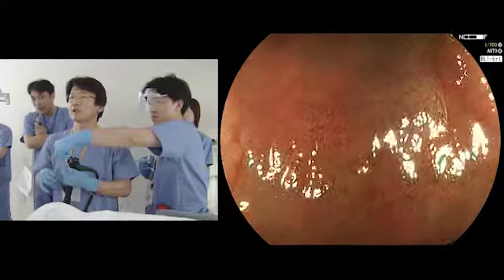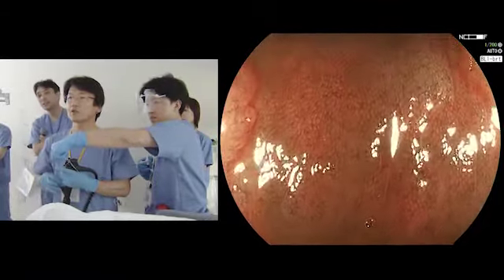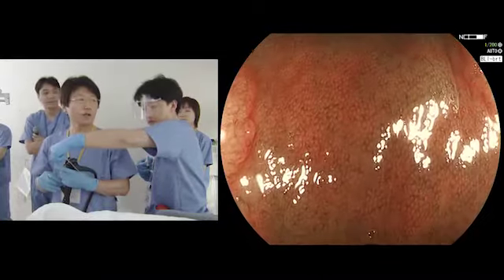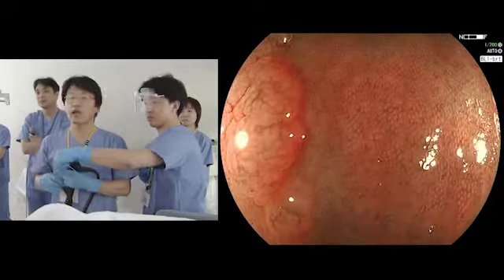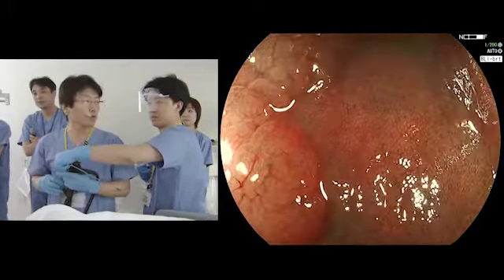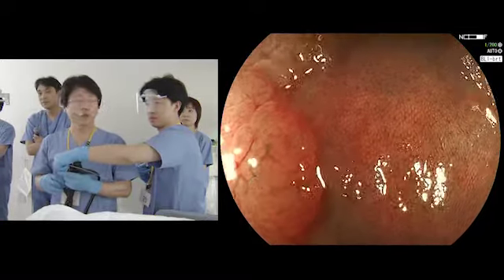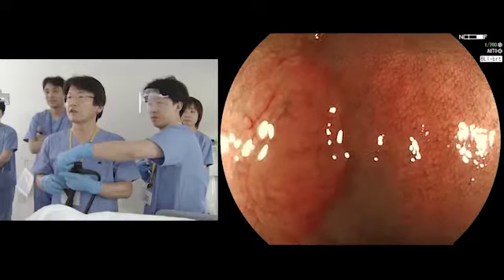What kind of current do you use to make a marking? I use a soft coagulation mode, and today I use VIO 3, the latest version of VIO, and I set soft coagulation effect 4.5. I don't know if that's effect or not, anyway, 4.5.